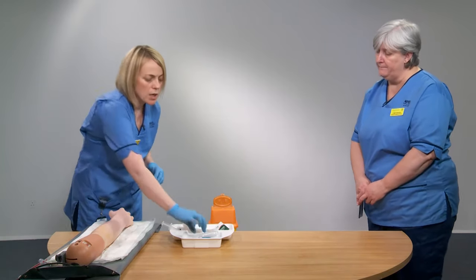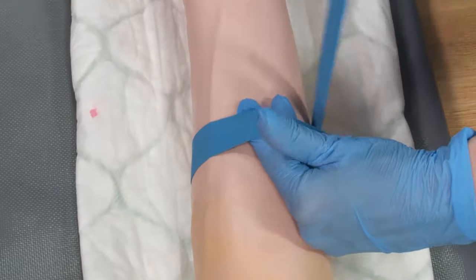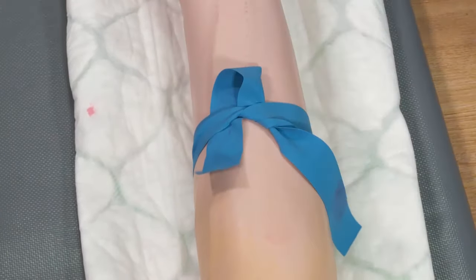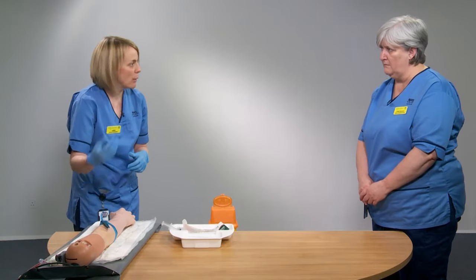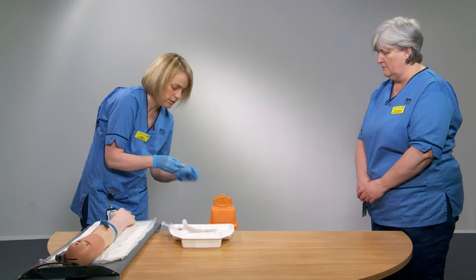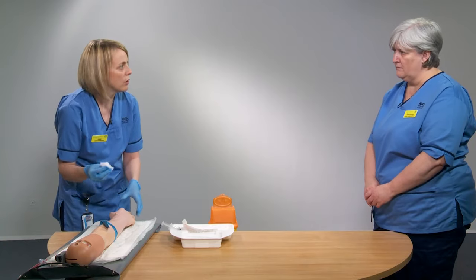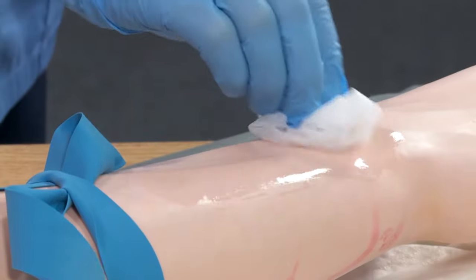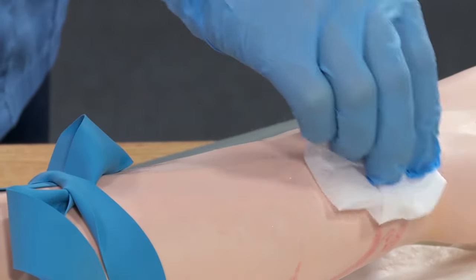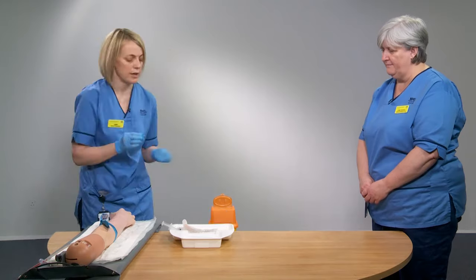I'm going to apply my tourniquet in exactly the same way as when demonstrating venipuncture — making sure that you have two ends at one side so you can release it quickly. Feel for a vein; you're looking for that nice bouncy vein. Give the area a good clean using your chlorhexidine and alcohol wipe. It's really important to think about how long your tourniquet is on — you don't want it on for longer than a minute. Use that lattice pattern for 30 seconds and allow it to dry, then dispose of the wipe in clinical waste.